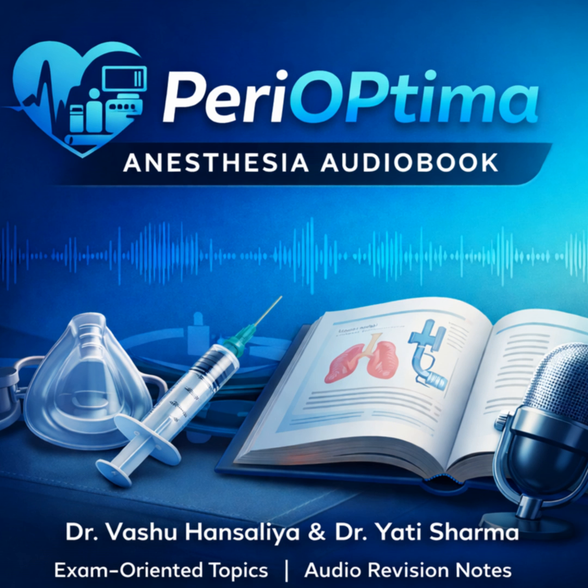No, not at all. It's a vital occupational health measure, and it's completely justified by the inherent toxicity of the agents we use, even at really low concentrations. Okay, but hang on. If we're talking about just parts per million of waste gas, isn't the environmental argument often seen as stronger than the staff safety one today? I mean, serious complications in staff are very rare now. That's a really perceptive question, and examiners love that kind of nuance. And you're right, with modern agents, the risk is low.